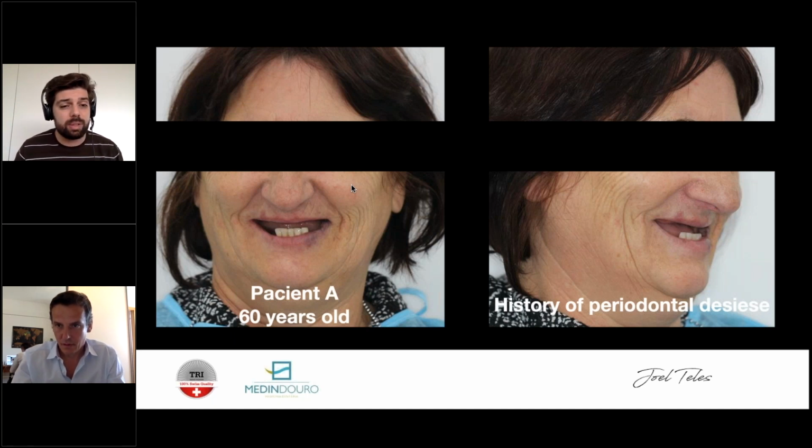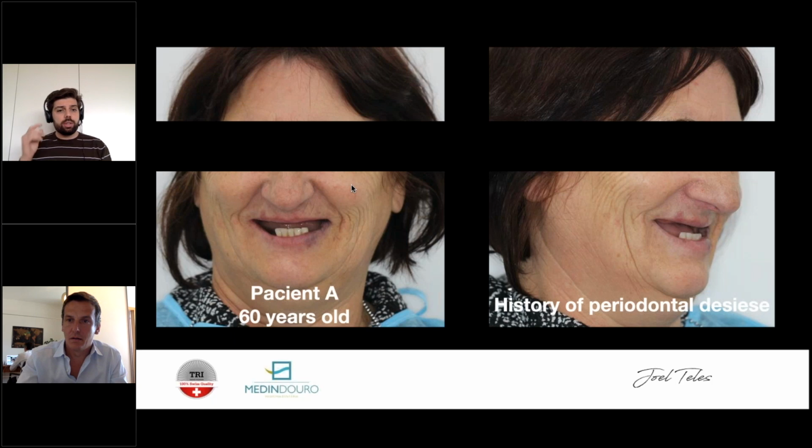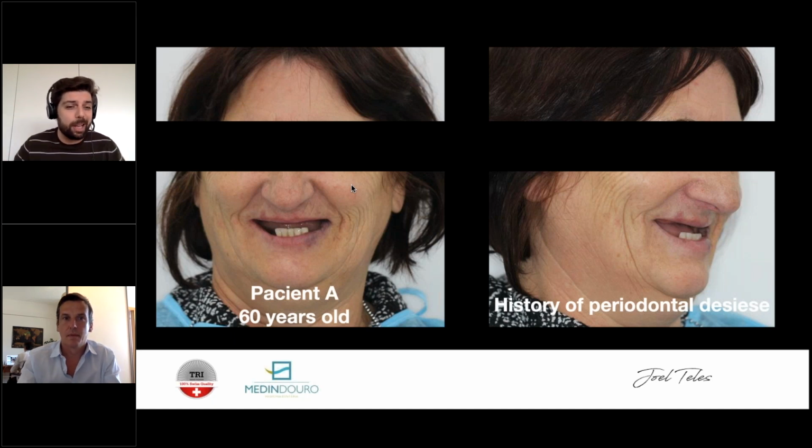What I do sometimes, if something happens, is that I immediately place, if I can, another implant that will stay there and that will be used afterwards. I placed it anyhow at that moment, so I can charge that one afterwards. This is something that I do, not that much, but sometimes I do. And sometimes I'll end up with all the 5 of them integrated, and I'll continue with the 5.